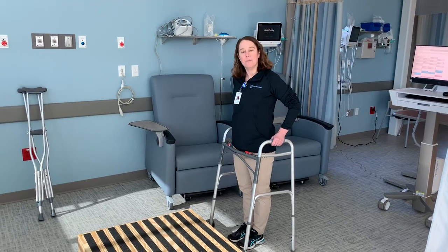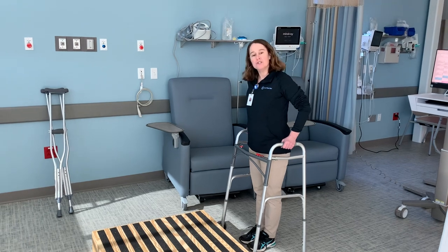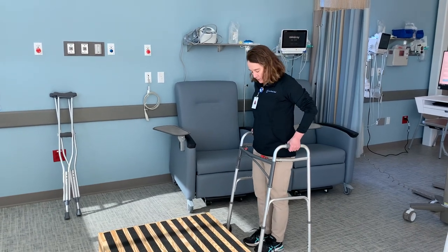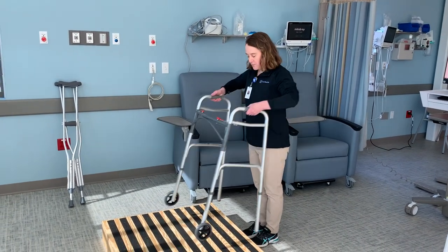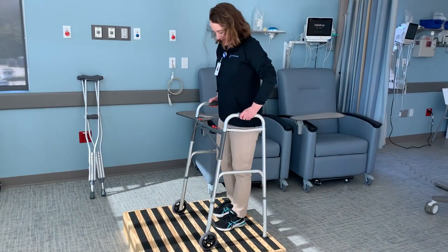After surgery, you're going to need to manage stairs and up and down curb steps. When you're using your walker, this is how you will do it. You'll come right up to your step, bring the walker up first. You'll go up with your good leg, just like that.